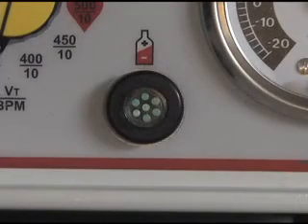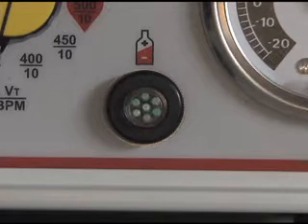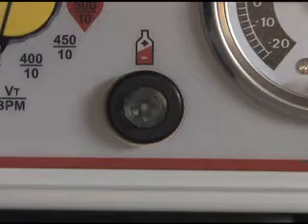The green visual gas supply indicator and short audible tone will confirm that the gas supply is turned on. Should the gas supply pressure drop below 40.6 pounds per square inch, the visual indicator will flash green to black, and a pulsed audible alarm will activate, warning the rescuer that the gas supply pressure is running low.